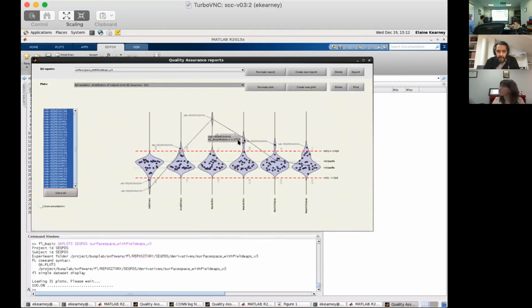Yeah, it's borderline enough to be not obvious that we should remove it, but also not obvious that it's not going to affect anything because it has very few. So those two subjects that have the lowest number of valid scans and the highest values for the mean motion are probably the two to keep in mind, just to make sure that they look relatively clean when we get to the first level analysis, to decide later whether we want to remove them or not.